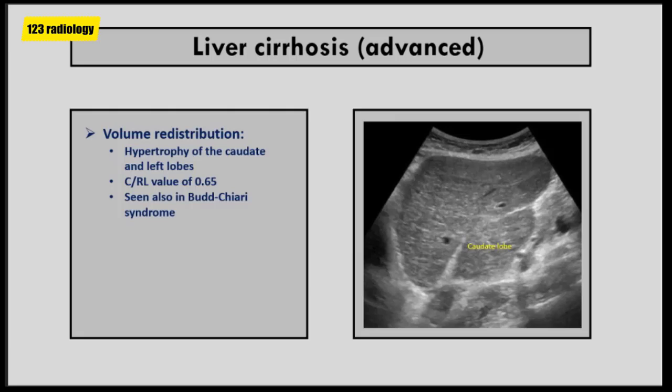More specific ultrasound features of cirrhosis are seen with late disease. One of these features is volume redistribution. In early stages the liver may be enlarged, but in advanced stages the liver is often small with relative enlargement of the caudate and left lobes compared to the right lobe. The ratio of caudate lobe width to right lobe width is an indicator of cirrhosis — a ratio of 0.65 is considered indicative of cirrhosis. However, volume redistribution is also seen in Budd-Chiari syndrome.